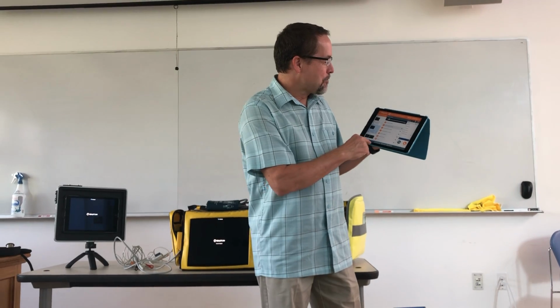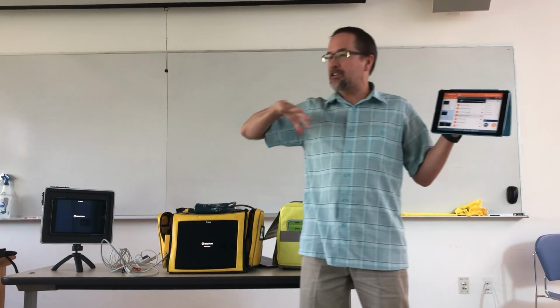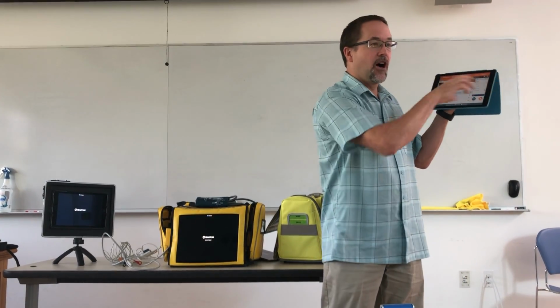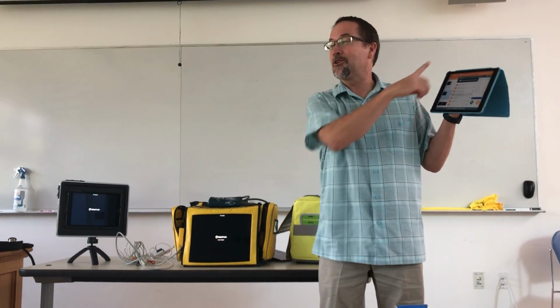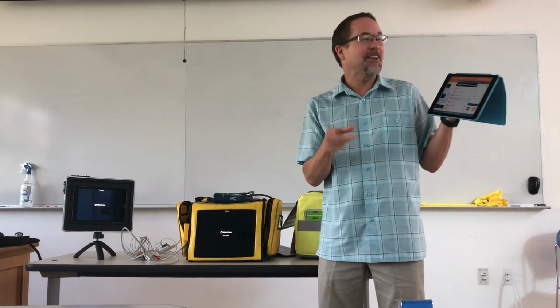Yeah. So on this log that pulls up with the debriefing, I have down here these little flags that I put in. If I'd had a whole class participating, I would see additional flags with a timestamp with the person's name. So it would say, Corey commented, or Corey said, or whatever. And so what I'm expecting to see is you'll hit certain points in the scenario. When you go to review it, you're going to see 9 flags in a row because every single person watching noticed the same thing. And that's a pretty good flag for you as a debrief.